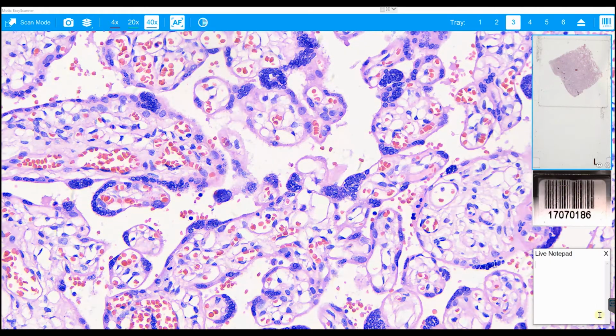The live Notepad is a great asset to the software, especially during times in which the user is in the presence of their patient. Instead of vocally discussing what is currently transpiring, one can easily write notes or leave shorthanded notes and continue to work on the patient. Using LivePad with either TeamViewer, Zoom, or any other remote desktop sharing software can definitely shorten the communication time between locations when diagnosing a patient.